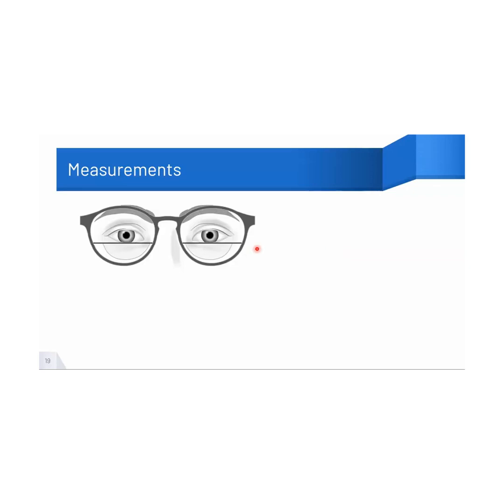Coming to measurements on the bifocal, all of us are aware, right? Basically, this is the measurement that we are taking. Ideally, I have just two questions here. I'm not getting very deep here, but my question is, in case your lower lid margin, for some reason, for laxity, has become loosened and is hanging, what will be the reference mark? How will you do the marking for the bifocal?